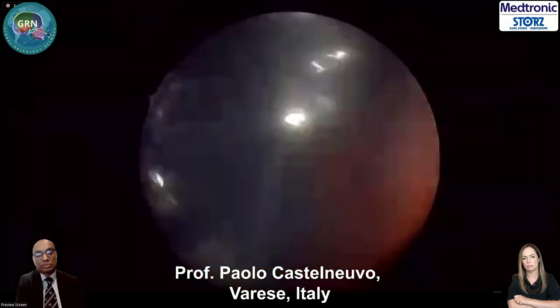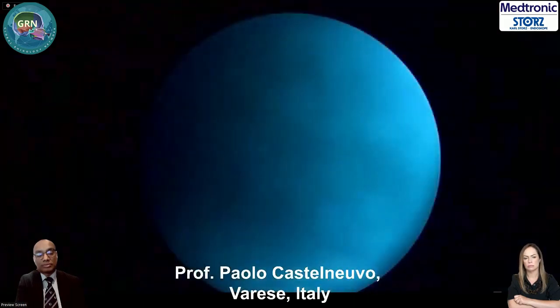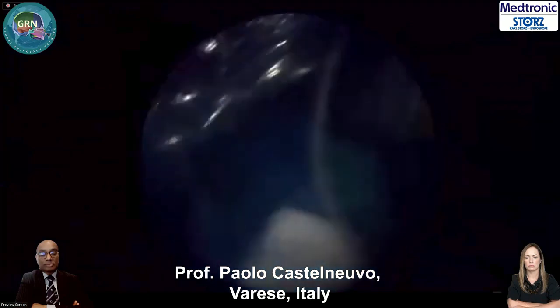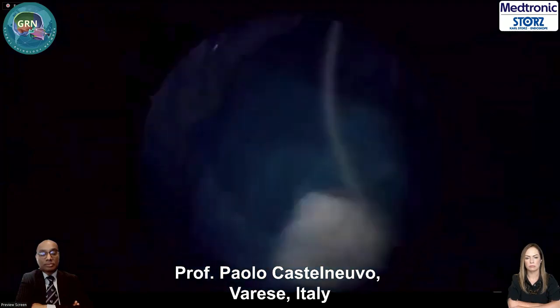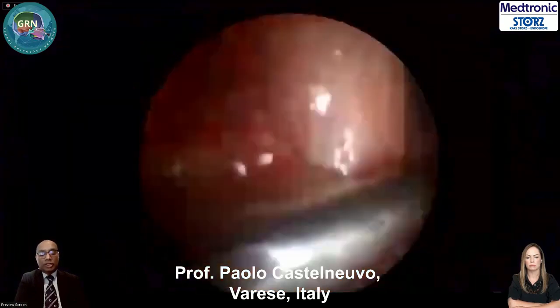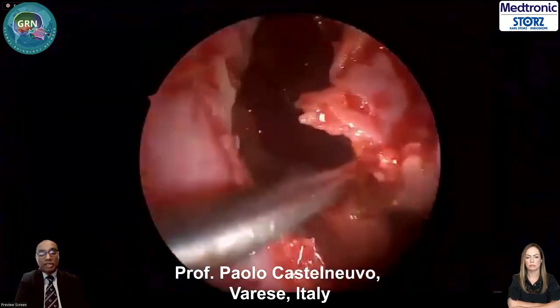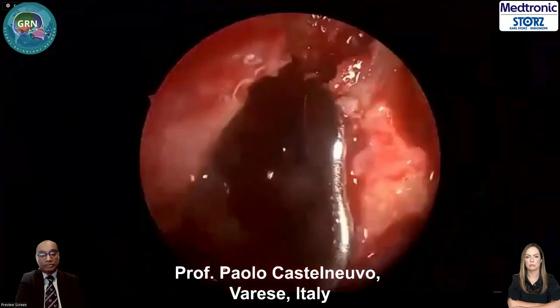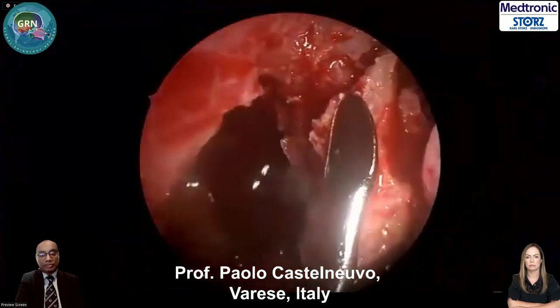So now we use the curved dissector. So with the Prof, curved dissector, the nasolacrimal duct is still intact, correct? Yes, the nasolacrimal duct is here and is intact.